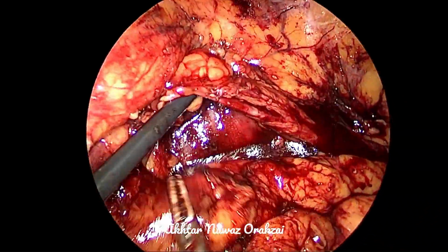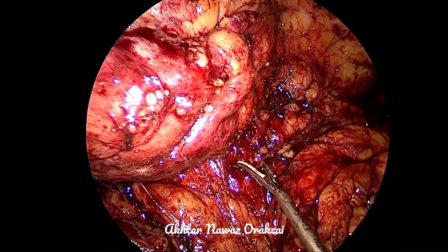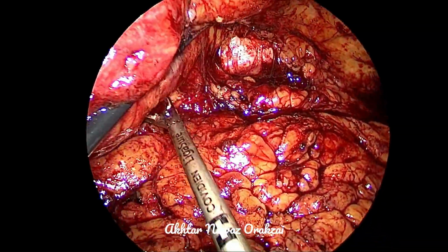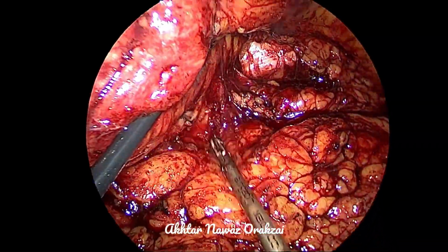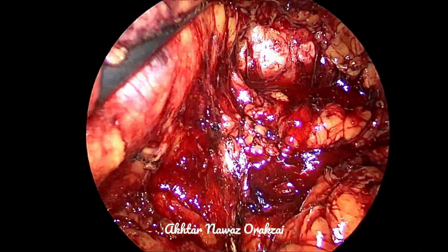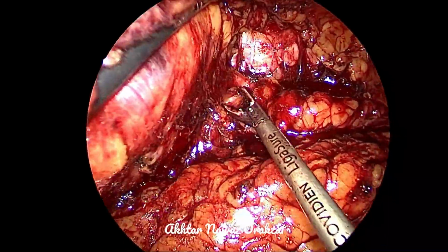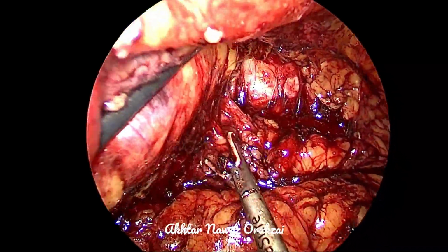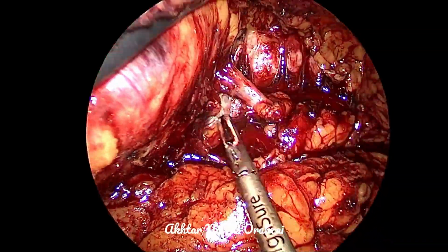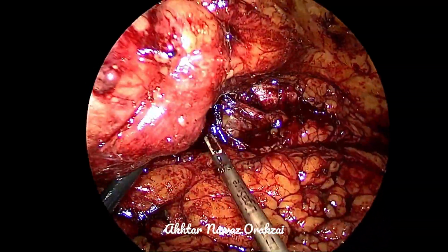But another important thing on the left side is the tail of the pancreas. So the tail of the pancreas is also very closely attached and adherent in this case to the kidney. So any signs or any doubts regarding the pancreatic tail have to be clarified.